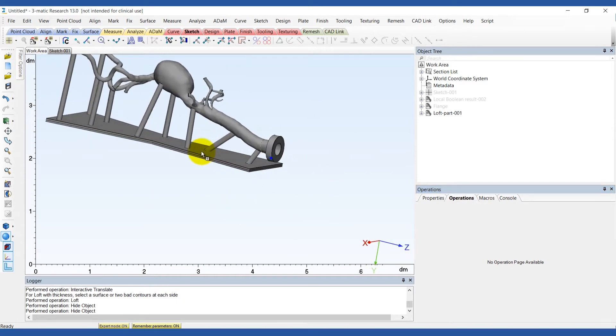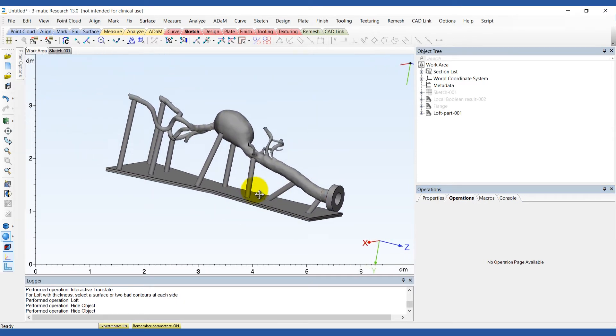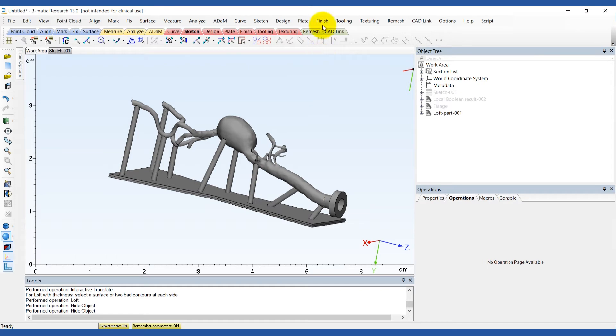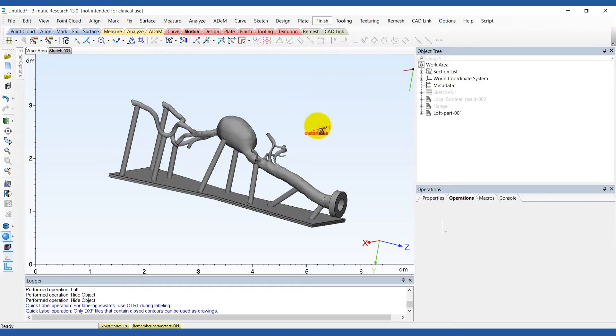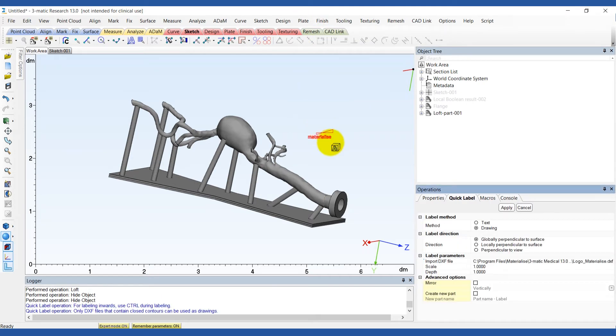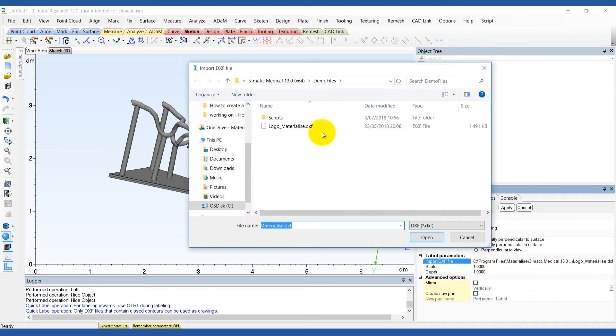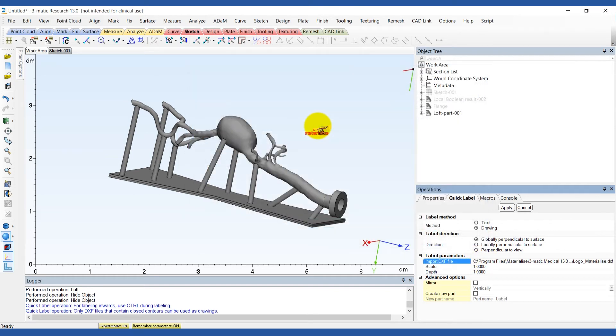If you want to brand your model by adding a logo, use the quick label tool in the finish menu. Select the drawing method and import a DXF file of the logo.